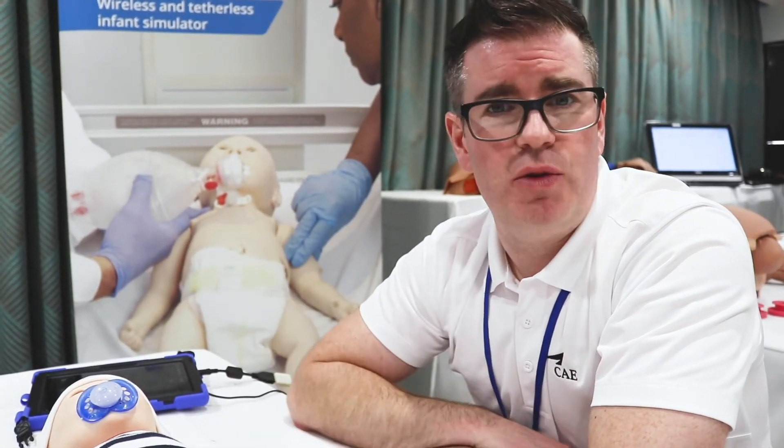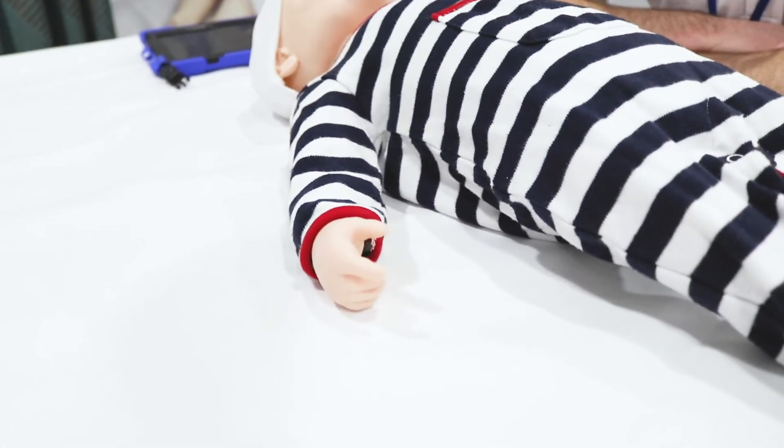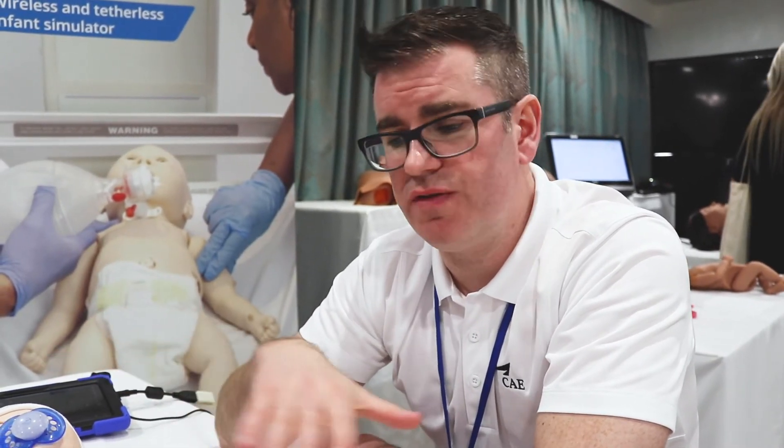As you can see, Luna has active arm movement to simulate a healthy child. We also have seizures. Luna has brachial and femoral pulses and an umbilical cord. If you want to simulate a scenario where the baby is a little bit older, we can take the cord off and place a plug in so she no longer has a cord.